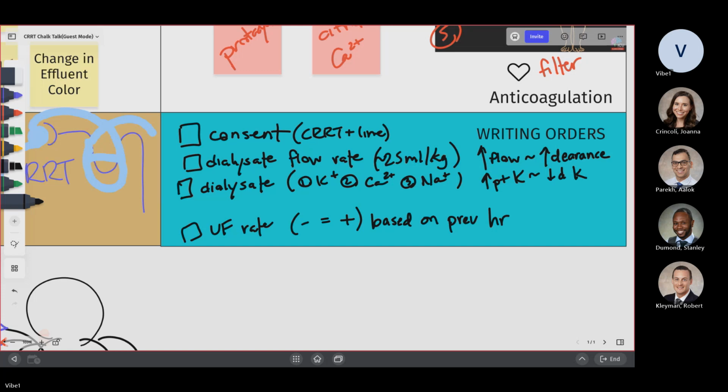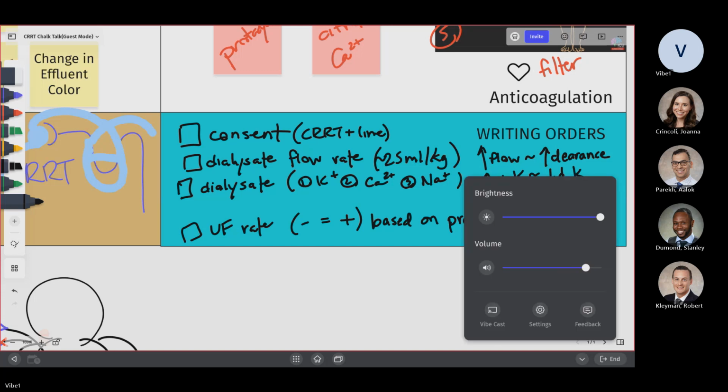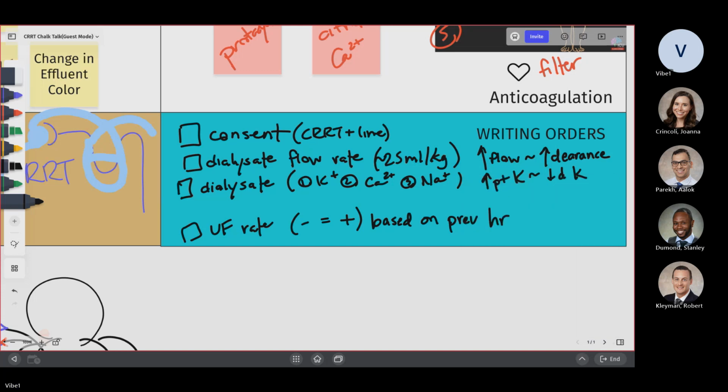So in that circumstance, what she will do is she will calculate, let's say the patient got 100 cc's of fluid during an hour. The next hour, she's not going to pull out any, because she's going to keep the patient positive by 100. Suppose the next hour the patient got 200, then she will only pull out 100 cc to keep the patient positive by 100 cc's an hour. So remember, running normal saline drips or anything when patients are on CRRT is basically useless. Okay, because you can always manage your fluid balance with the CRRT machines.